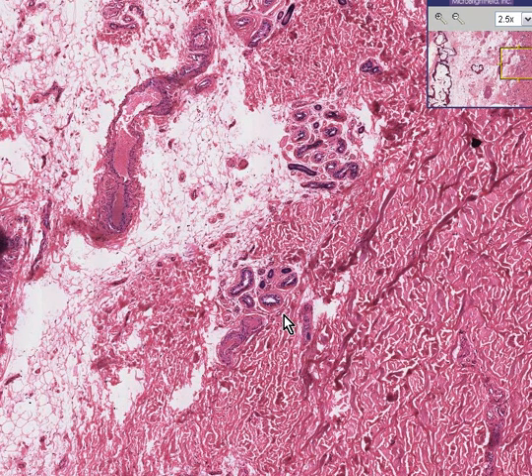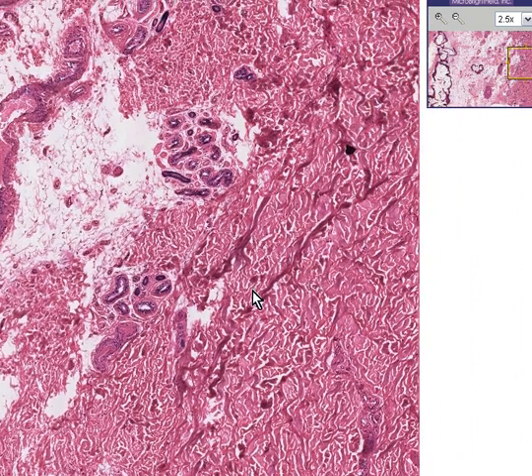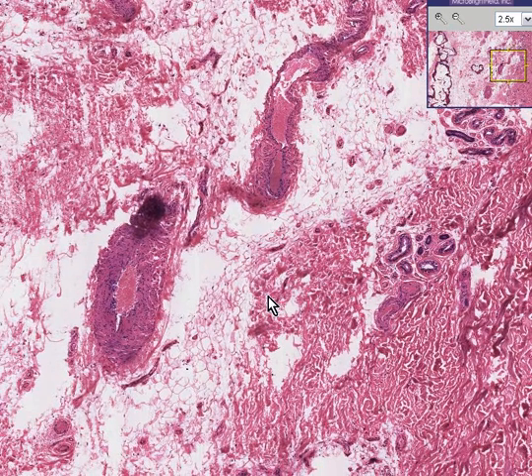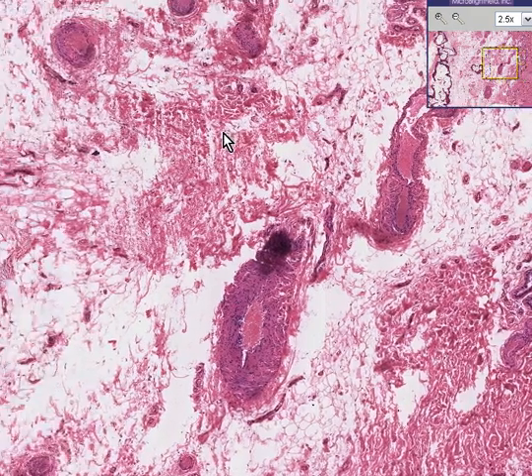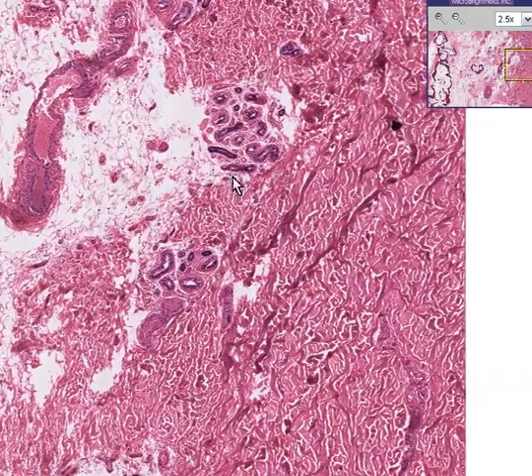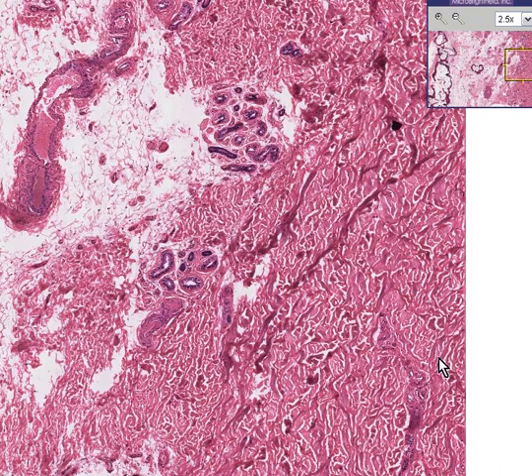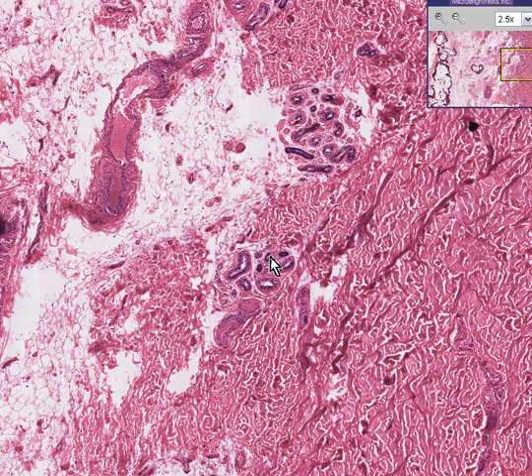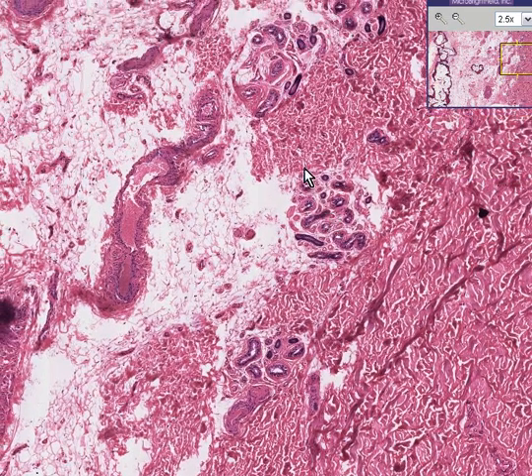Here is soft tissue. You could recognize the fact that there is fairly dense fibrous connective tissue here. The fibrous tissue is looser out here and there's more fat. Even though it's called soft tissue, this area here has been abruptly cut — this could very easily represent skin, because these look like skin appendages or sweat glands.